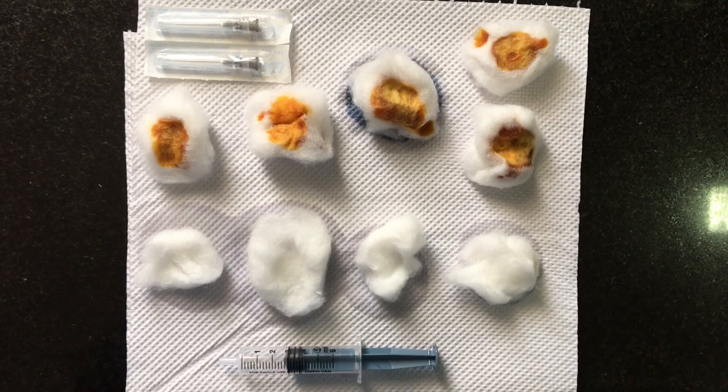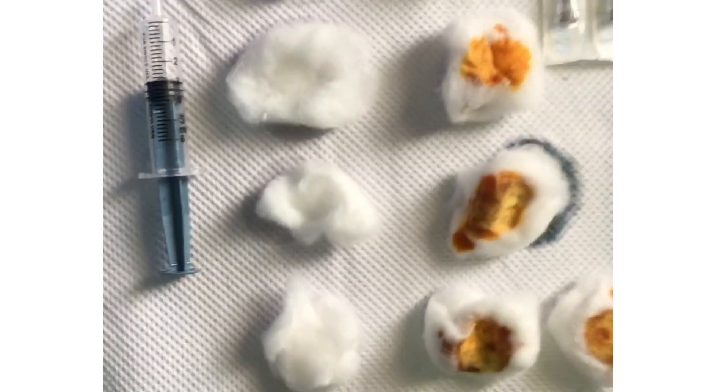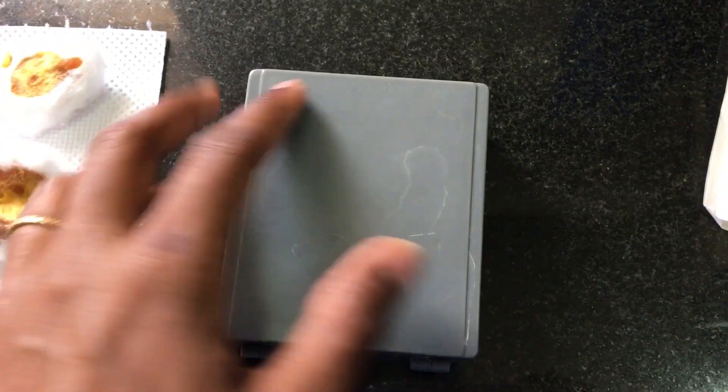You also need four cotton swabs with surgical spirit, a 5 ml syringe, and 22 gauge needles. Make sure you also have one cotton dipped in betadine to apply pressure after the procedure, as well as a glass slide and a box to keep all the slides safe.